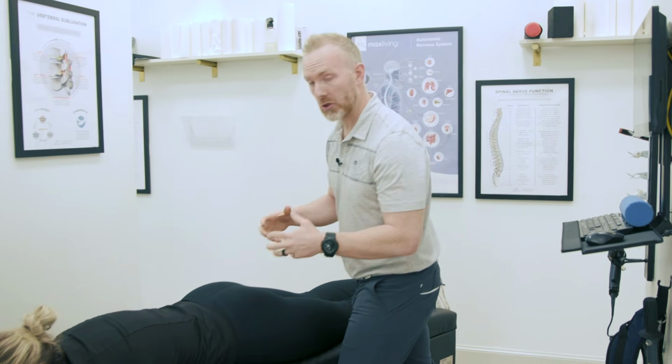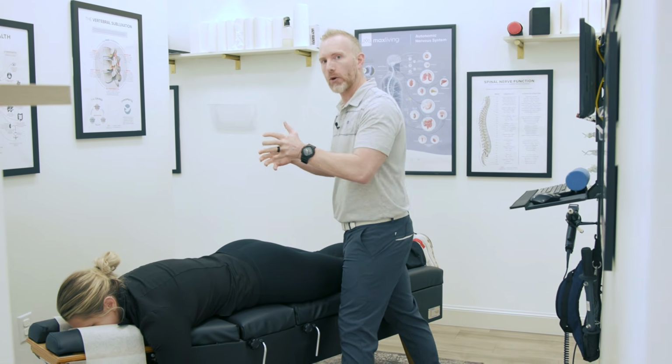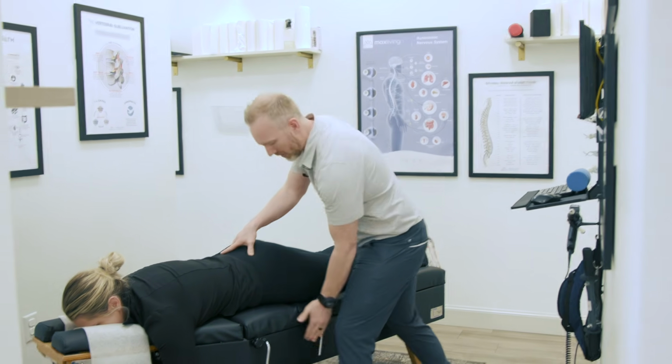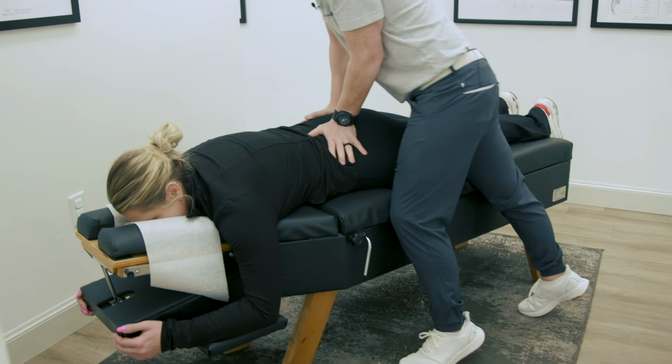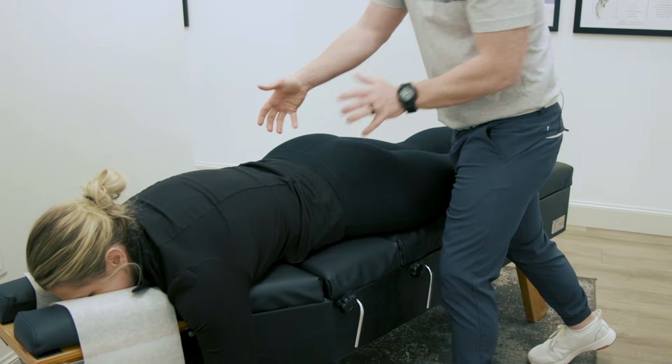And so we're going to do a light adjustment and kind of walk you through how we tend to correct these sorts of misalignments. The first way we can do it is utilizing the table and doing some drops to help specifically correct that rotation in her hips. So this pops up, and that's going to help to balance that rotation that we saw.